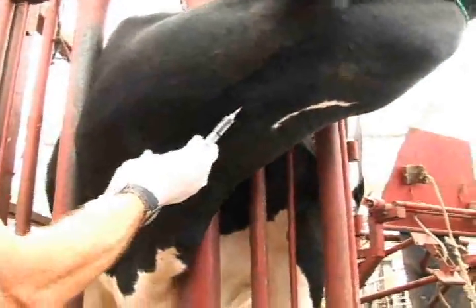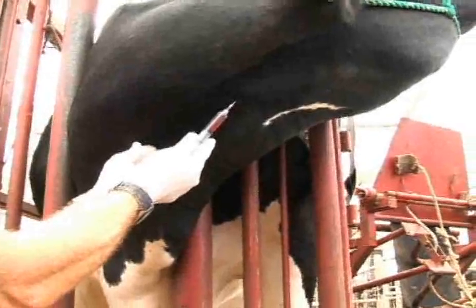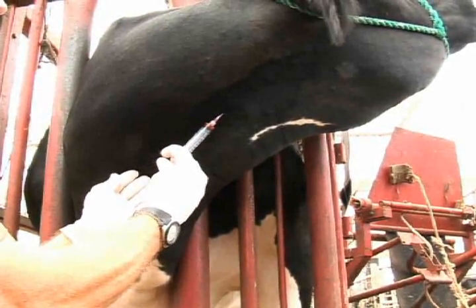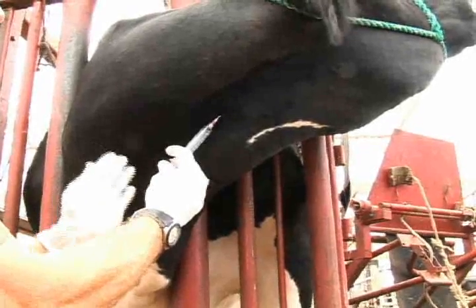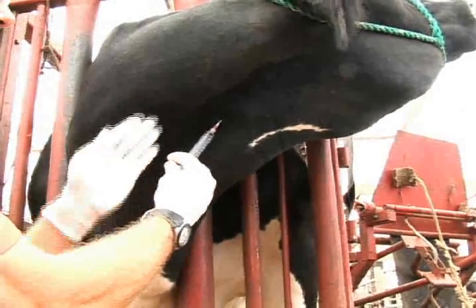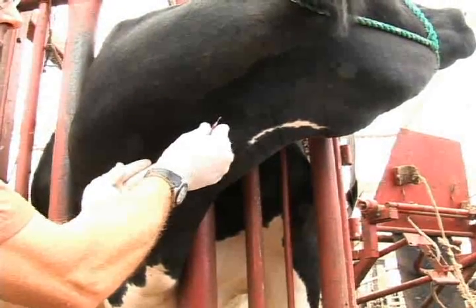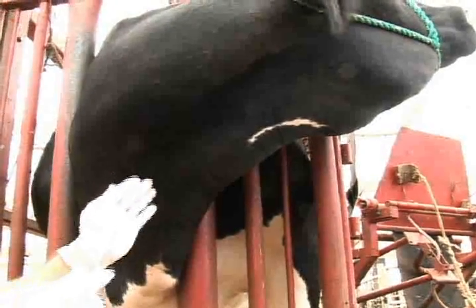Once you're into the jugular vein, you draw back and you get blood. Once you get blood, you can dispense the large volume of medicine intravenously. Release your hands away from holding off to allow the medicine to clear the area, and then completely remove the needle out of the cow's vein.